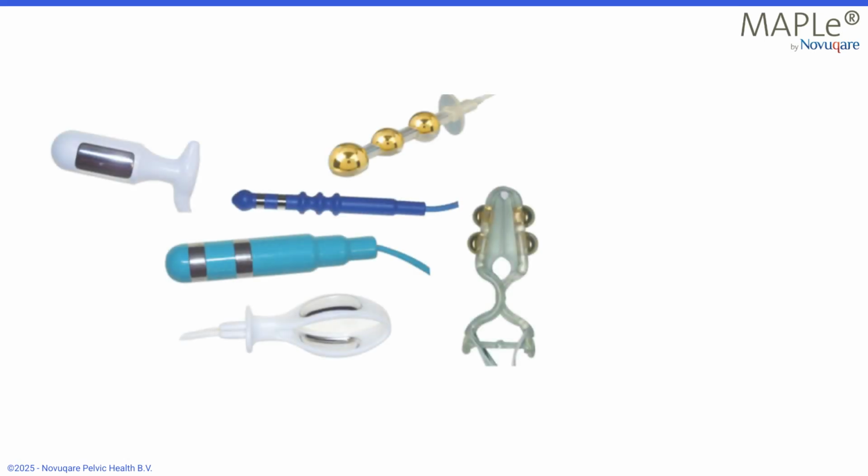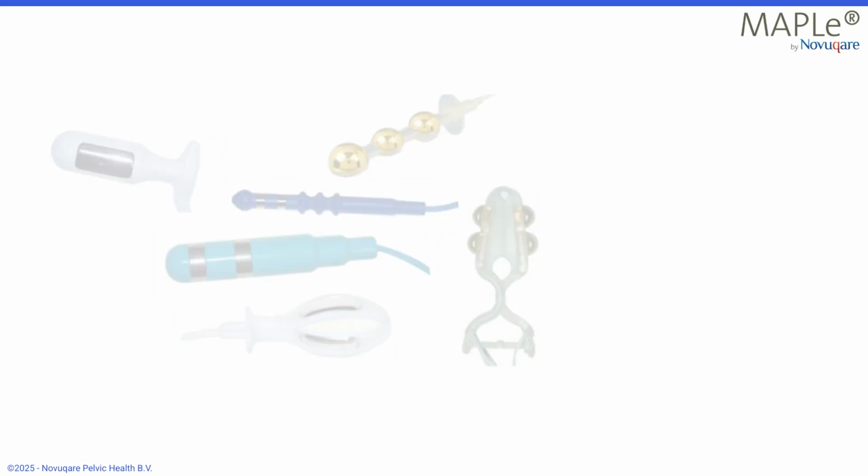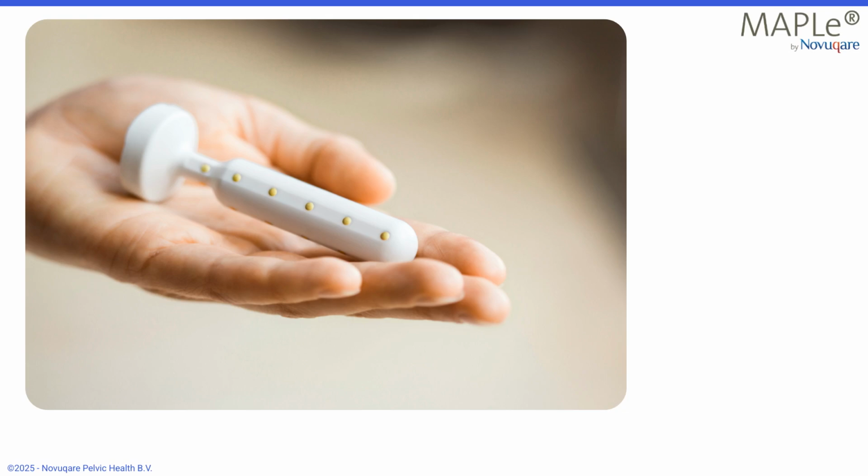Electrode size and placement. Larger electrodes, as used in older equipment, can handle higher amplitudes, activating more muscles. Maple uses smaller electrodes with different properties. Continuously evaluate and adjust settings to achieve optimal results.